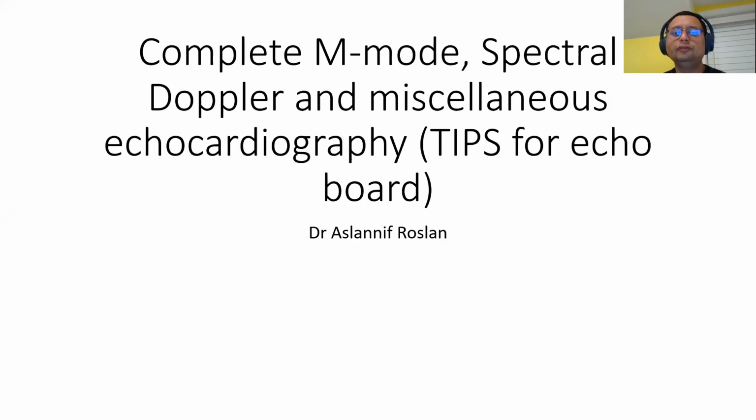Okay, good evening, everyone. Today we're going to do a little bit of talk on complete spectral Doppler and also some miscellaneous echocardiography. I think this is important especially for people going for the echo board, because there are really going to be a lot of questions based on M-mode and spectral Doppler that they expect you to diagnose.